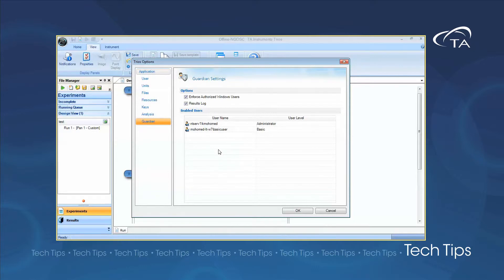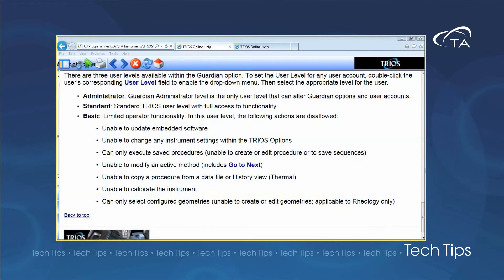There are three levels of authorized users. The administrator has full functionality of the TRIOS software and is the only user that can alter Guardian options in user accounts. The standard user has full functionality of TRIOS software. The basic user has limited operator functionality and is restricted in their ability to update the software, change instrument settings, modify procedures, and calibrate the instrument.